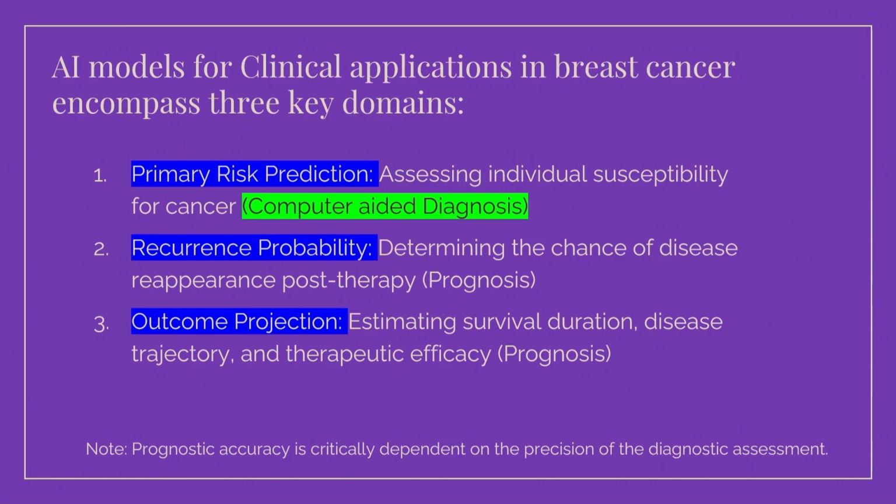Number 3 is to predict, between treatment plan A and plan B, which one is better, or whether diagnostic method A or B will bring a better diagnosis. So altogether, I think it's actually what our doctors are doing, but in a better version. So AI is to support our radiologists and doctors to make better predictions.